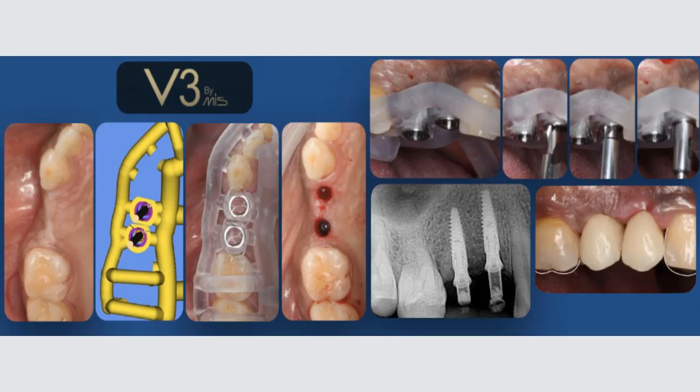So here is just one example. I scanned the patient and I sent. In this case, I did flapless implant placement. Regardless if I do flapless or if I open a flap, I guide all the implants I'm placing nowadays. There is a simple reason. There is no reason to not do so. That's the major point. People ask me about doing this flapless, if it is precise.